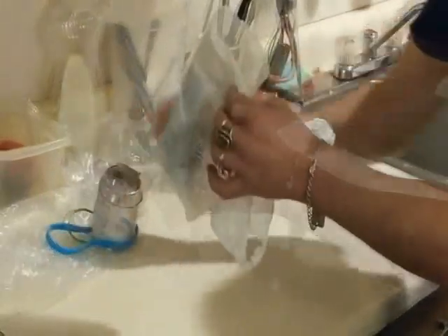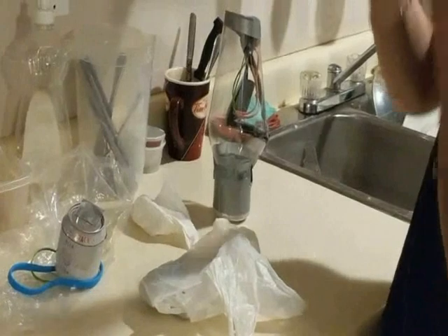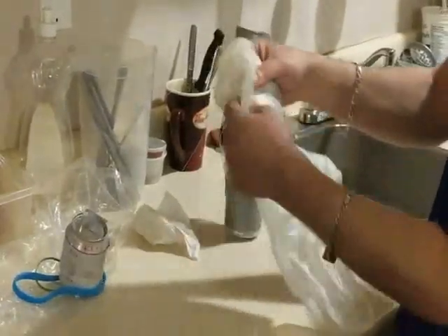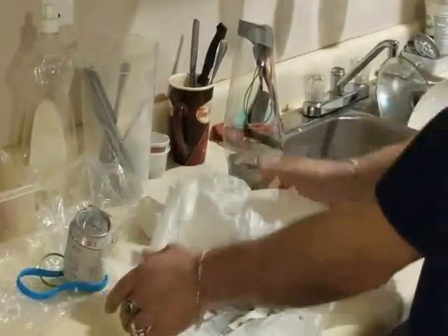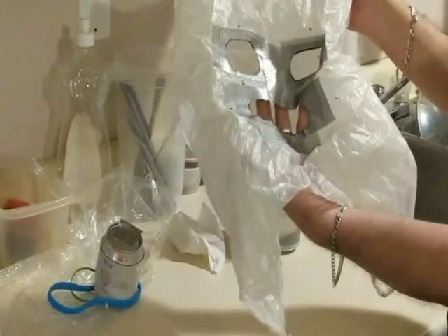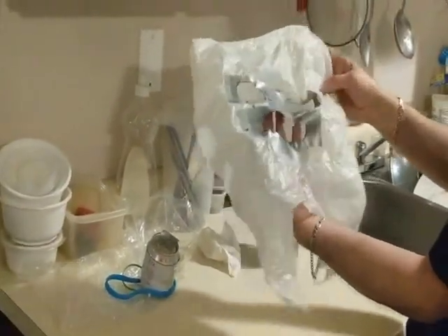Okay, so now we're going to move on to the bag, my special feature that will work hand in hand with the COVID-19 filter mask, N95, with your homemade filtration mask or your shield mask. It's a grocery bag. Make sure you don't use a dollar store bag. They are really cheap. Grab yourself a really good bag and you could be making exactly what I'm showing you there. It's almost like a Halloween mask that you'd be making out of a garbage bag.